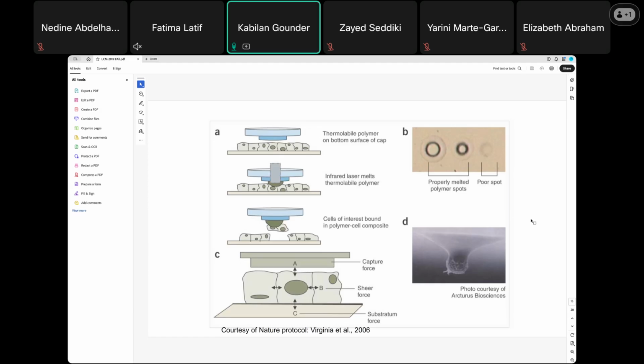We already discussed that previously, when you dissect samples to separate them from healthy tissues, there will be contamination because of imprecise dissection and manual error. When you separate healthy cells from tumor cells, infected cells or malignancies, there will be contamination, either cancer cells or healthy cells.